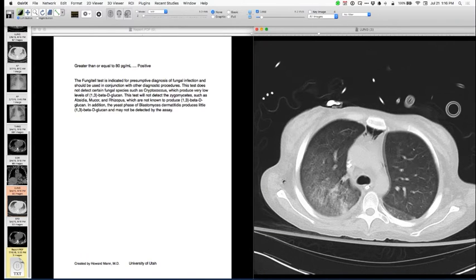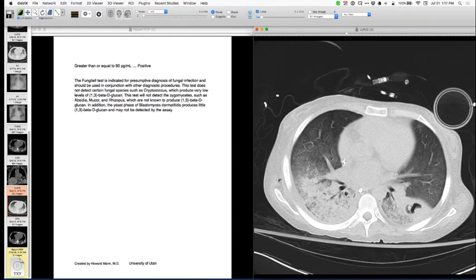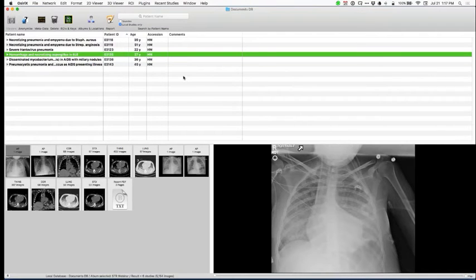All right, Jeff, I can show more if time permits, but those are mine for now. Okay, thank you, Howard. David, do you have any cases? I can show a case here. Okay. And maybe the second one.